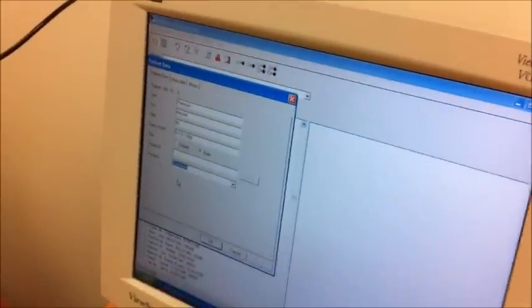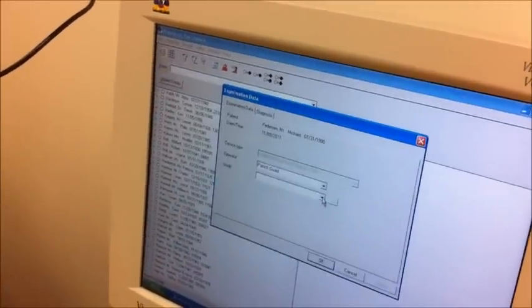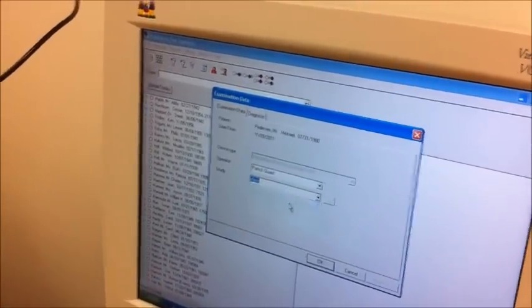I'm going to put in the ancestry, that's important for the database. So then we click on OK, and we just click which clinic we're in, so I'm just going to click on Clinic.